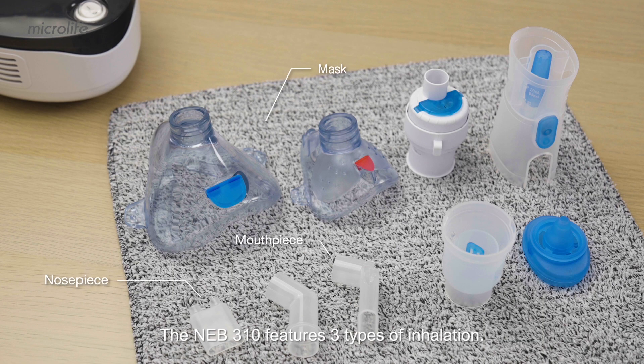The NEB310 features three types of inhalation. The mouthpiece gives better medication delivery to the lower airways. The nosepiece provides efficient treatment to the upper airways.